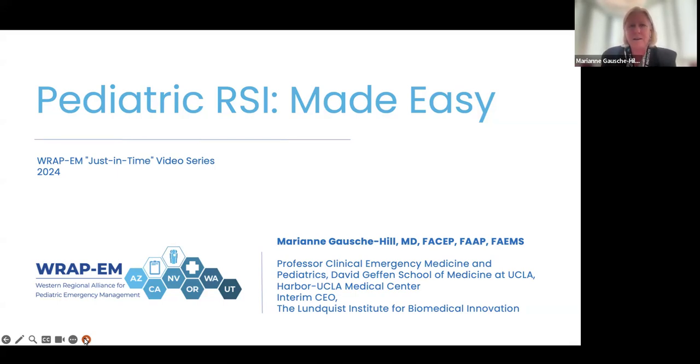And the other thing is to have several bag mask ventilation devices. I would have an infant and a pediatric bag. Certainly, those should always be available in any resuscitation bay that you have, just so that even if somebody walks in with their limp child, you're ready to go. And the next thing is just assemble your team. Take a breath, assemble your team, and get your bag mask device and start thinking about how you're going to proceed in this resuscitation. And generally, you always start simple and then move to the more complex.